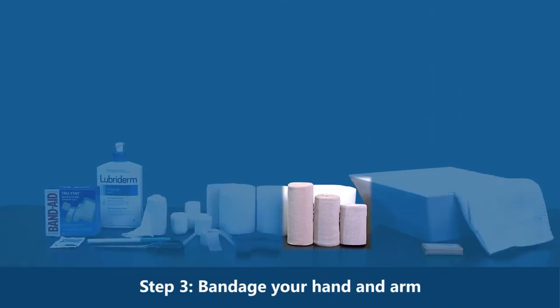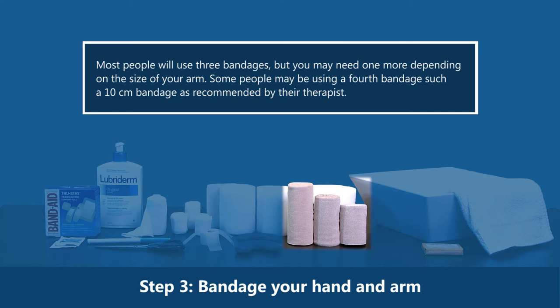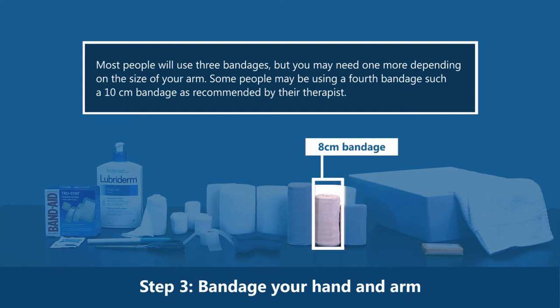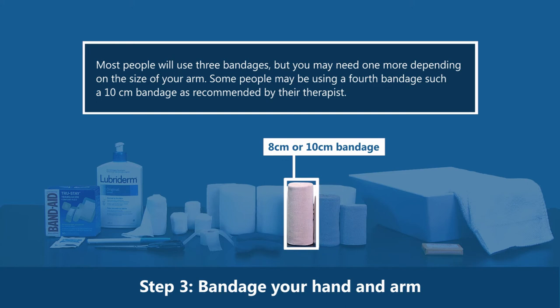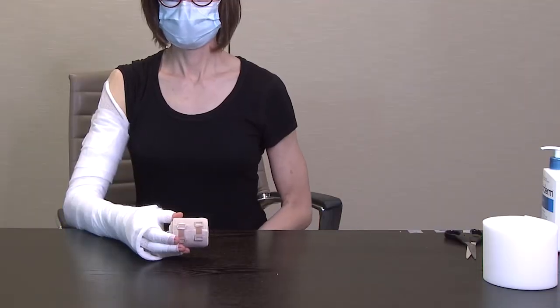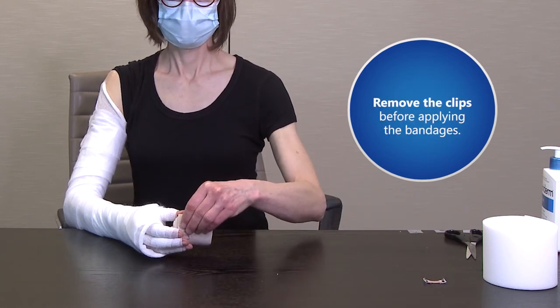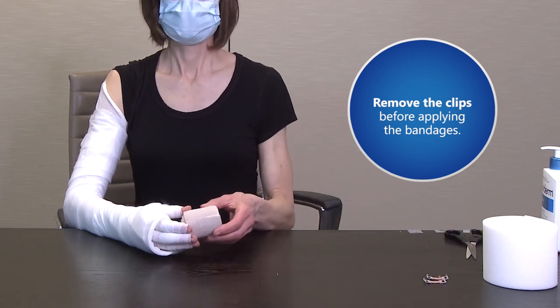Step 3: Bandage your hand and arm. Most people will use three bandages, but you may need one more depending on the size of your arm. Bandage 1 is a 6 cm bandage, Bandage 2 is an 8 cm bandage, and Bandage 3 is an 8 cm or 10 cm bandage. Some people may use a fourth 10 cm bandage as recommended by their therapist. The bandages come with two small clips — do not use the clips as they have sharp prongs that may cut your skin. Remove the clips before applying the bandages and use surgical tape instead.